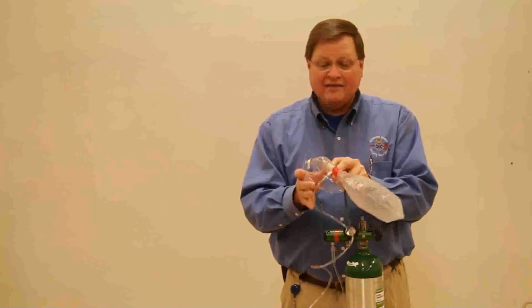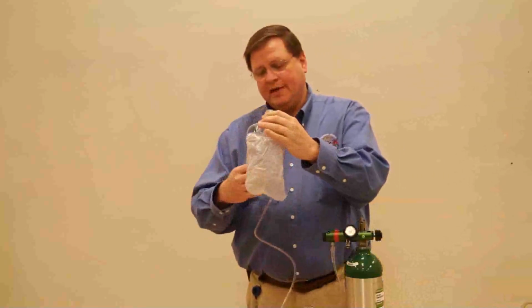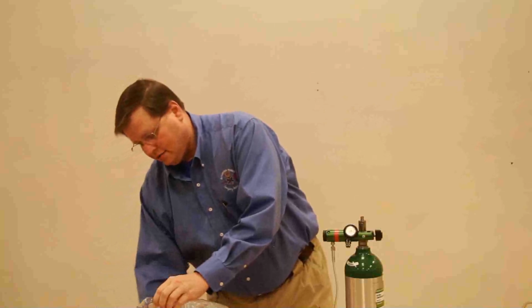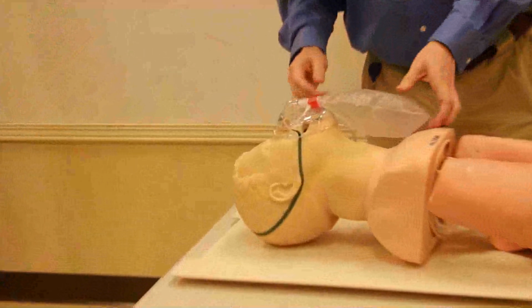Now, after you get the reservoir full, then you can put it on your patient, again BSI, on your patient, and put the strap around the neck, around the head, and have the patient breathe.